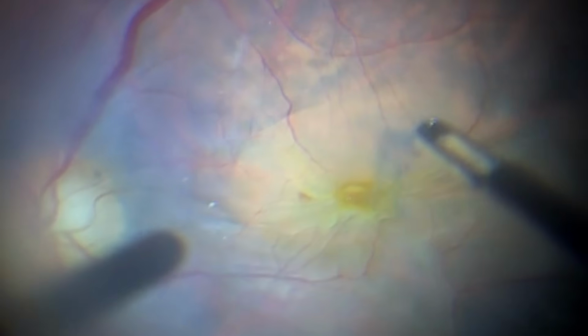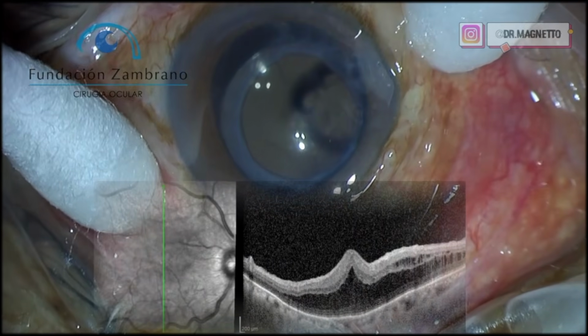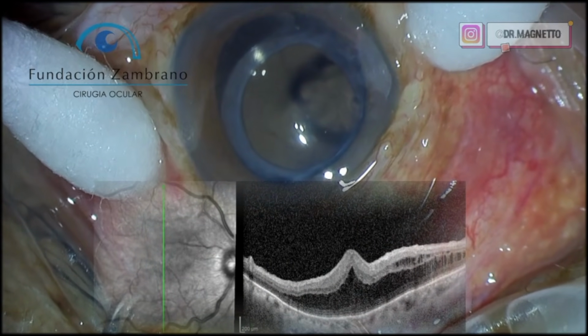At the end, the OCT shows residual foveoschisis, without areas of traction, with a tendency to improve over time.